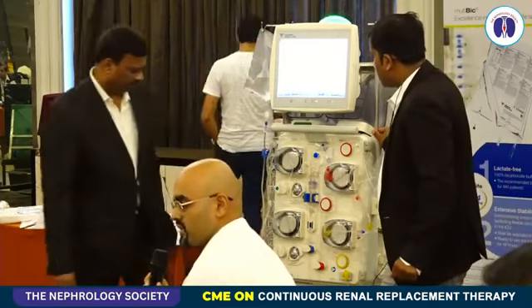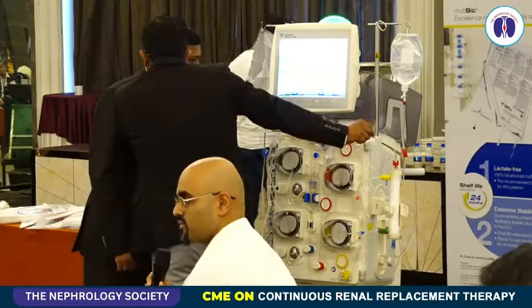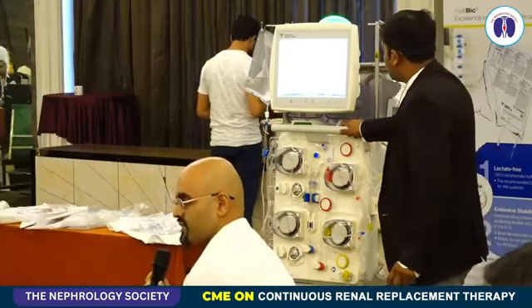If the patient is on pressors, we usually don't do a net ultrafiltration initially for the first 5-6 hours, and then once the patient is stable, we start adding ultrafiltration and then reassess the patient periodically.